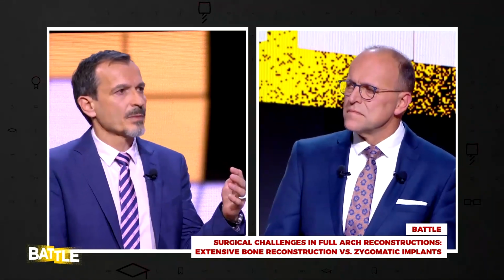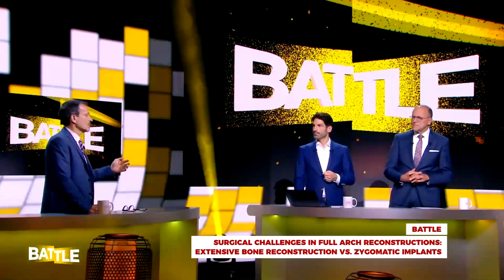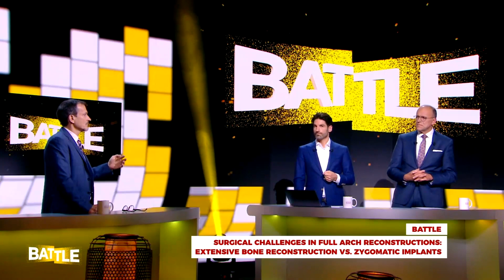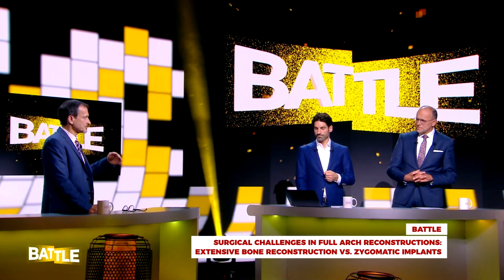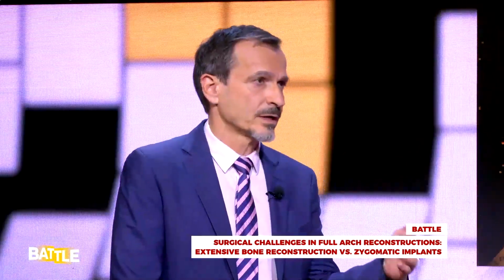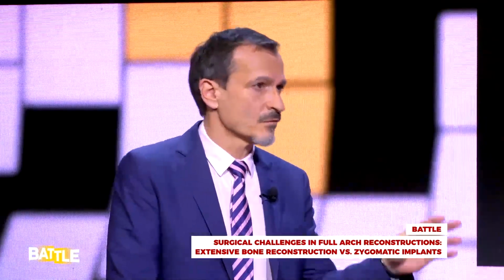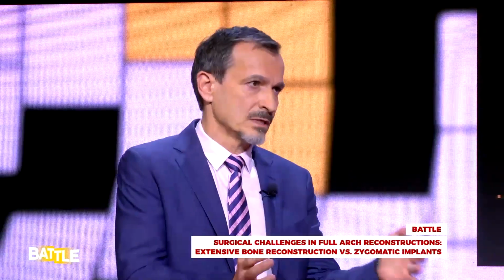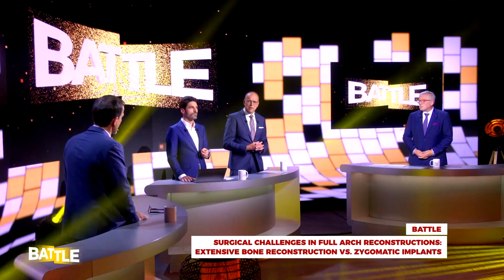So it's all about preoperative planning as well. We didn't speak about that. In all the cases that we are doing, we just have a CT scan, and then we insert it into a software, and then we plan and play around and see where is bone, where is enough bone, where do we need some bone. And I guess at the end, in discussion with the patient, we decide what to do. Of course, it's a joint decision making. You have to include the patient's opinion.